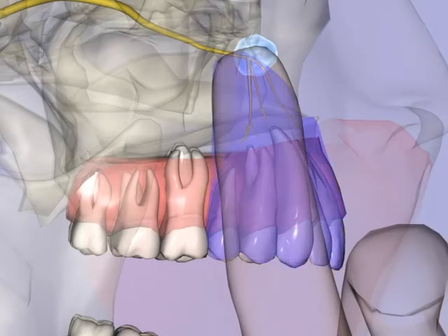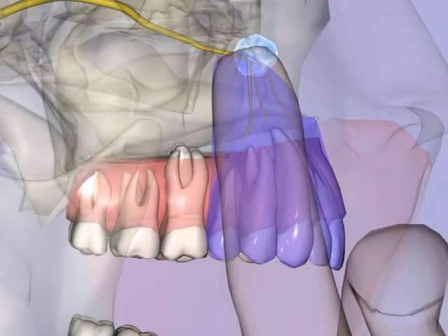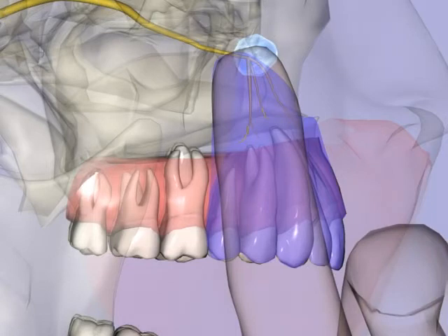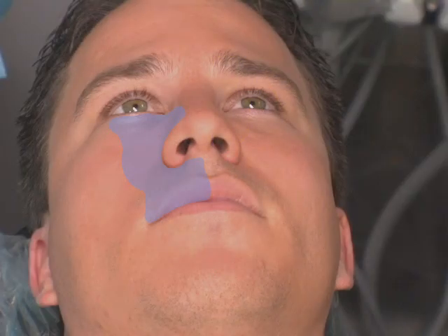Blocking the anterior superior alveolar nerve. The five maxillary anterior teeth — incisors, canine and premolars — and their supporting buccal soft tissues and bone are anesthetized. In addition, the soft tissues of the lower eyelid, lateral side of the nose, and the anterior part of the face are anesthetized.